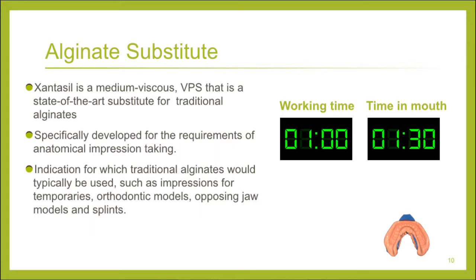The other thing is, I always tell patients I'm going to take a series of impressions, because this way if I have to take more, I can. A lot of times these polyvinyls that are out there, especially this one, take really good impressions. And it's really great for me to be able to send that to the lab, and guess what? The lab can pour it, not me. The lab actually prefers to pour it because they want to use their own stone. I don't have to worry about them calling me and saying, Shannon, I'm sorry, but I dropped the impression. I need you to get the patient back in. There are lots of things that can happen in transit. So I like to let them do it, and it's a short period of time.